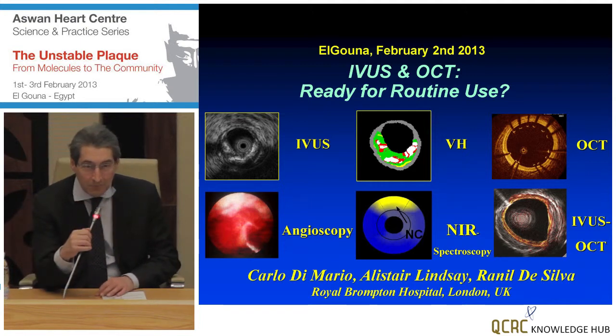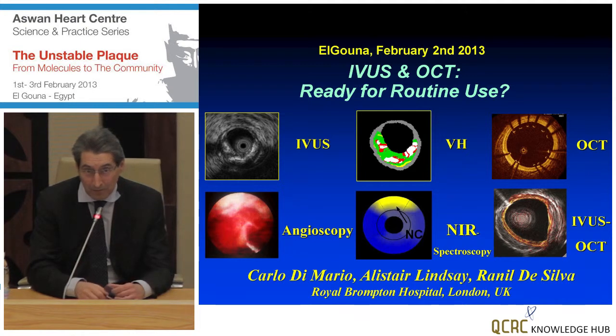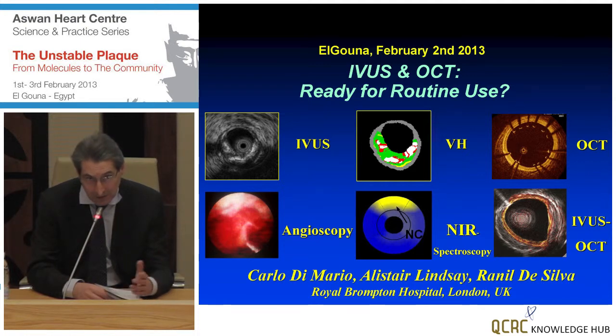Is it true? Well, definitely there is a difference in terms of measurement if you compare, and the OCT measurements tend to be lower. I think there were various explanations for that. One was that probably at the beginning our calibration method was not as sound as it is now with the machines of both vendors, so it was maybe a true mistake of the OCT measurement. The second, however, more likely, is that with OCT you truly can delineate the contour, and you can detect protrusion of plaque within stents that is almost invisible with intravascular ultrasound. So you tend to miss the soft component of plaque, thrombus, and plaque protrusion that reduce the true lumen. In my view, this is the main reason why you have, especially in acute coronary syndrome, differences between the measurements with the two techniques.